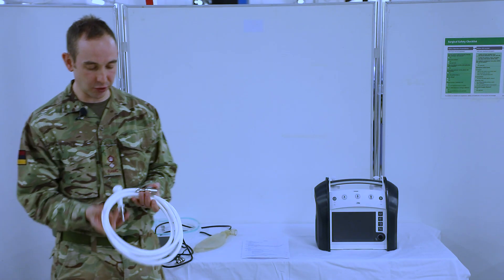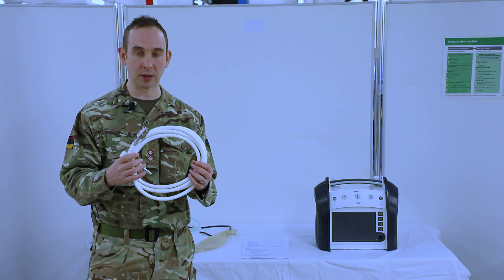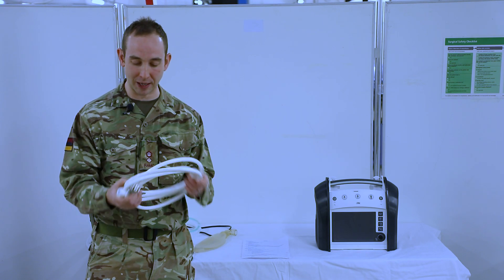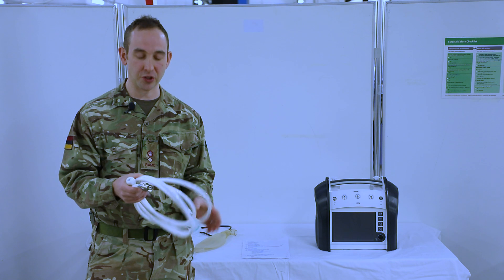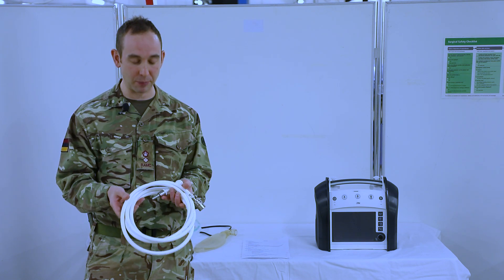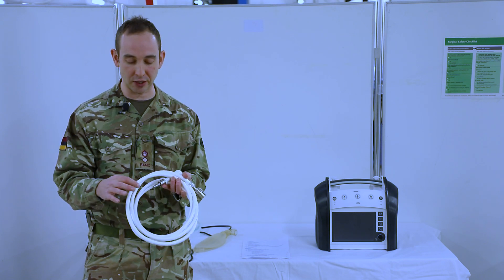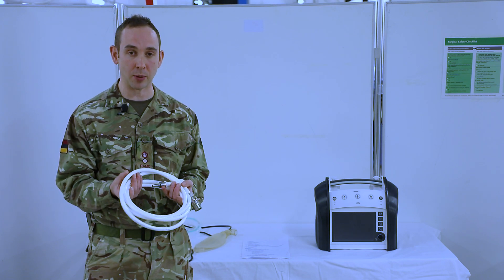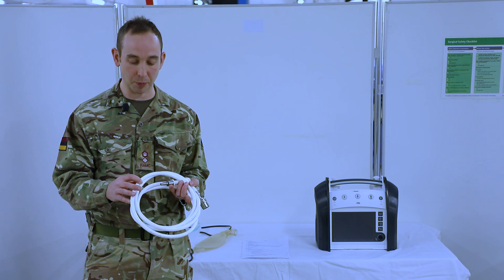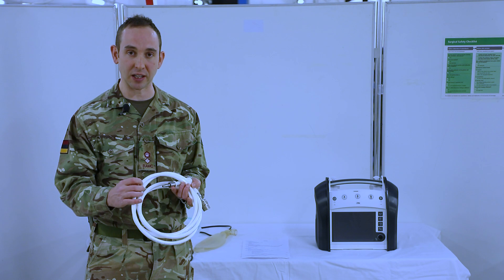The next part of this is to check the oxygen hosing itself. First of all, we're going to inspect the hosing and ensure that there is no dirt or damage to the hose itself. The second part is to check that it has been checked by MDSS — this should be done every four years. This one doesn't have a checked sticker on it, purely due to the fact it's brand new out of the box, but once this has expired after four years, it will need an MDSS check and then it will have a sticker placed onto it.